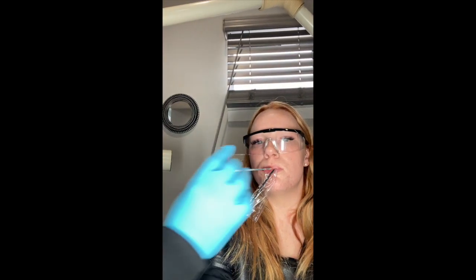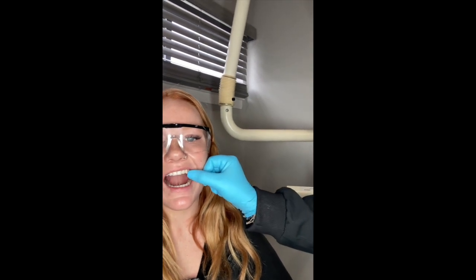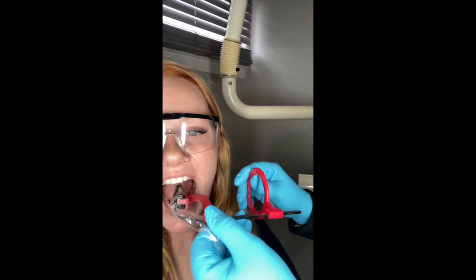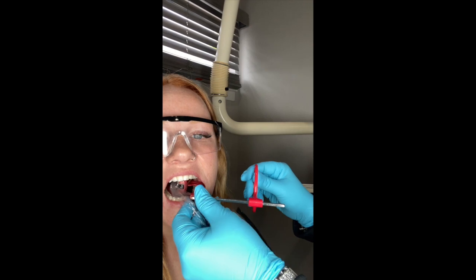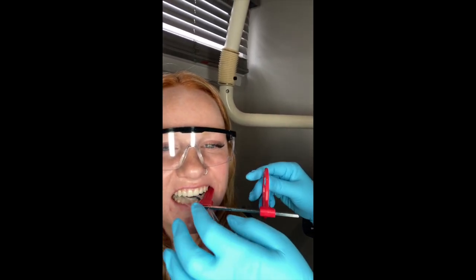Come back, move this away, and have the patient go ahead and open. Move over to the other side — same thing here. This is our premolar shot. Our goal is to get the distal of her canine. We're going to place this just a little slanted because this side is not straight. To get that premolar, we're going to turn it just a little slanted to fit into the palette. Go ahead and bite gently — you can see it's at the distal.